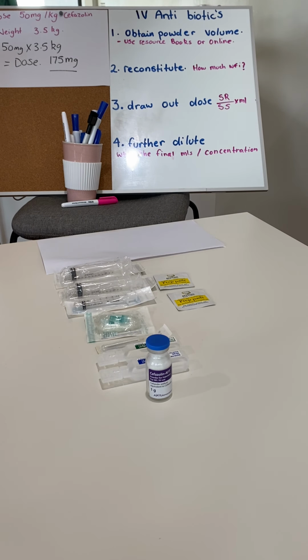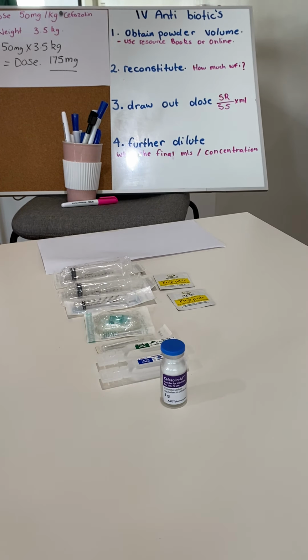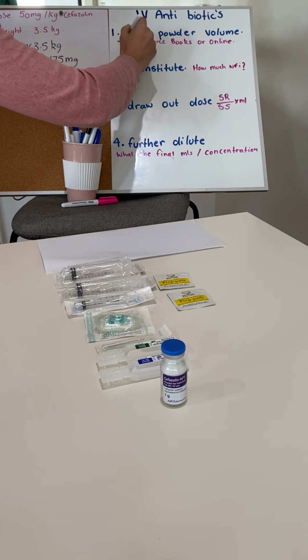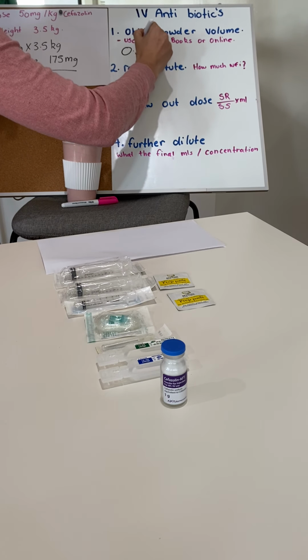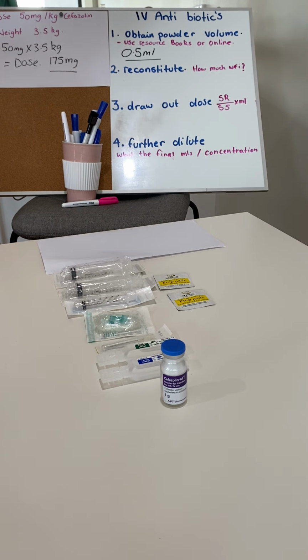The next thing we need to obtain is our actual vial of medication. In that, we need to know how much powder volume there is. So right now we have our cefazolin vial, and I've gone on to our online resource books, which I use, the Paediatric Injectable Guidelines written by the Royal Children's Hospital. And that's going to tell me that my powder volume is 0.5. So this is important, and this is a new step for paediatric. What that's saying is in this vial, there is already 0.5 of a mil worth of volume. So when we're doing our reconstitution, we need to take this into consideration.